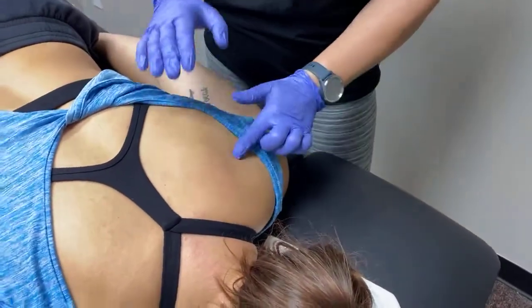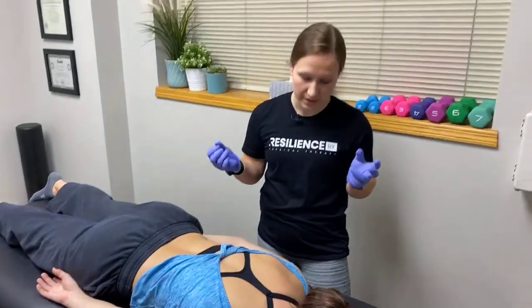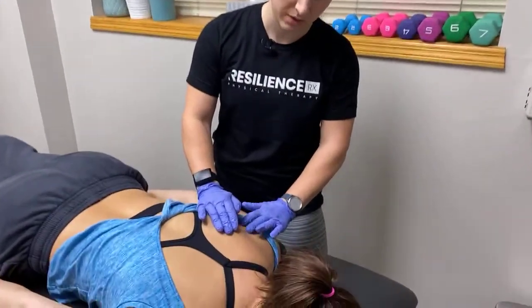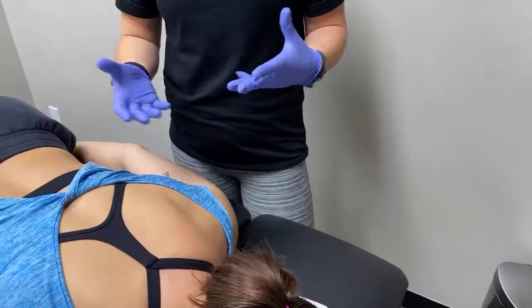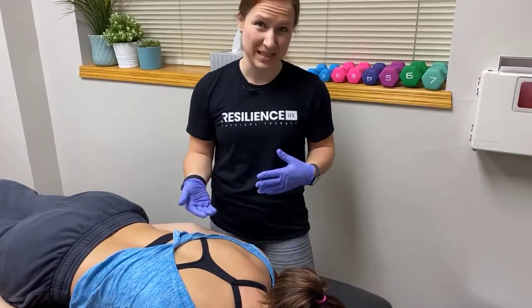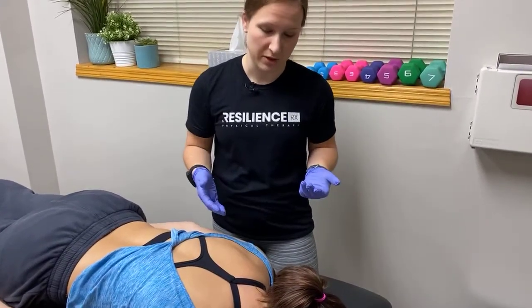In this muscle, there's usually some trigger points or painful or tender areas that when I poke on them, kind of like right in through here, Lindsay's got a nice one, those cause pain. Sometimes that pain is reproduced in the front of the shoulder, sometimes it's not, but targeting this muscle for rotator cuff pain can be really beneficial.